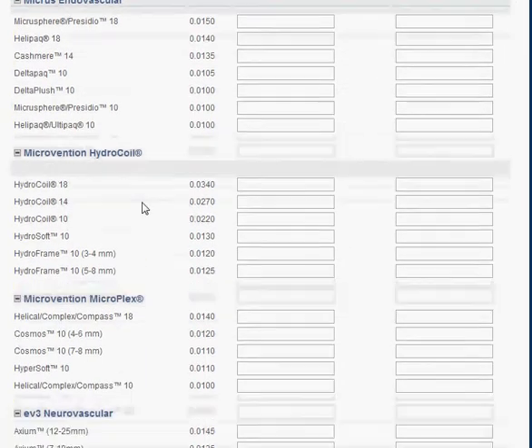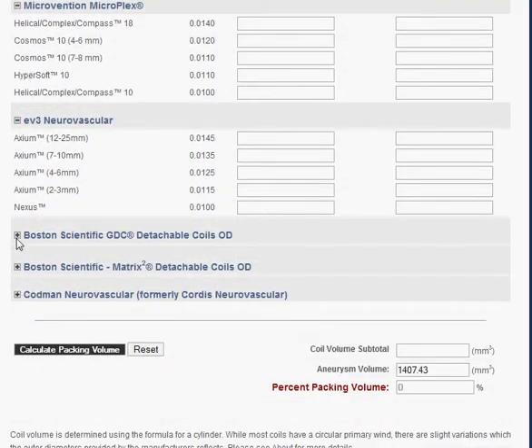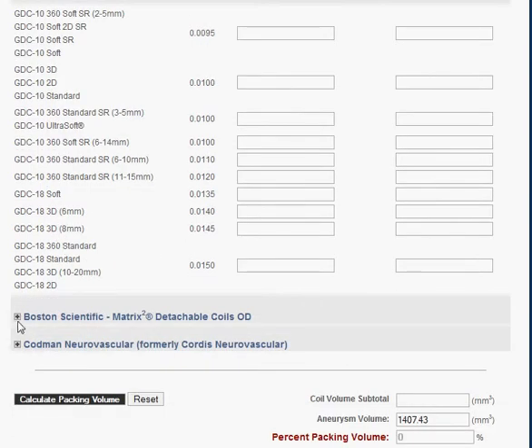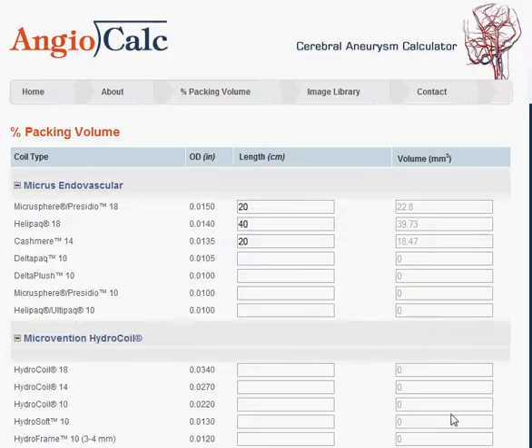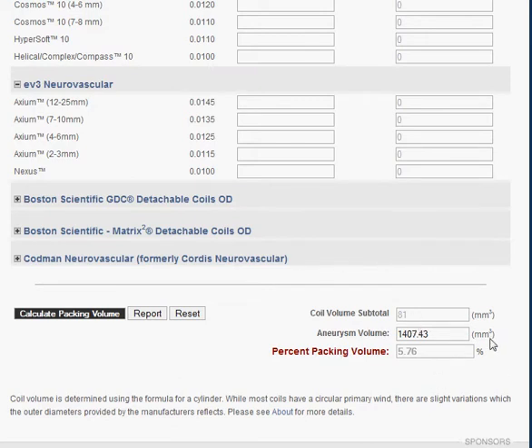This lists all the available manufacturers. Enter in the total length of coils deployed. To access these hidden manufactured coils, just click the button next to the name, then hit calculate packing volume. This shows the volume for each individual section of coil, and down here you have the coil volume subtotal, aneurysm volume, and the percent packing volume.